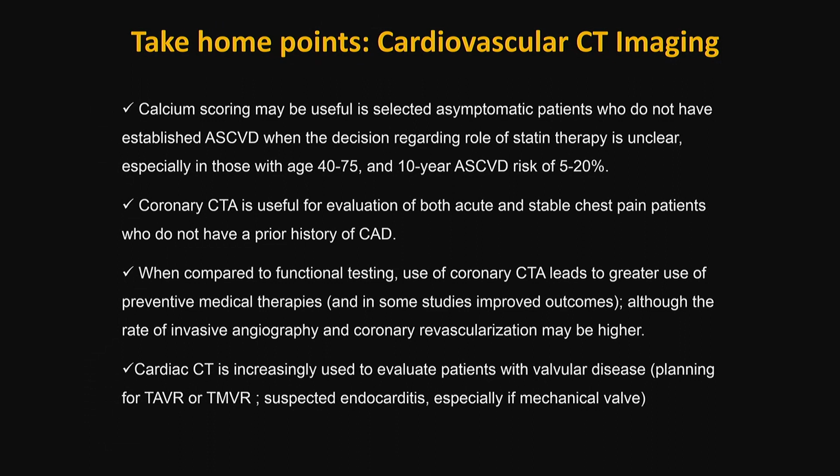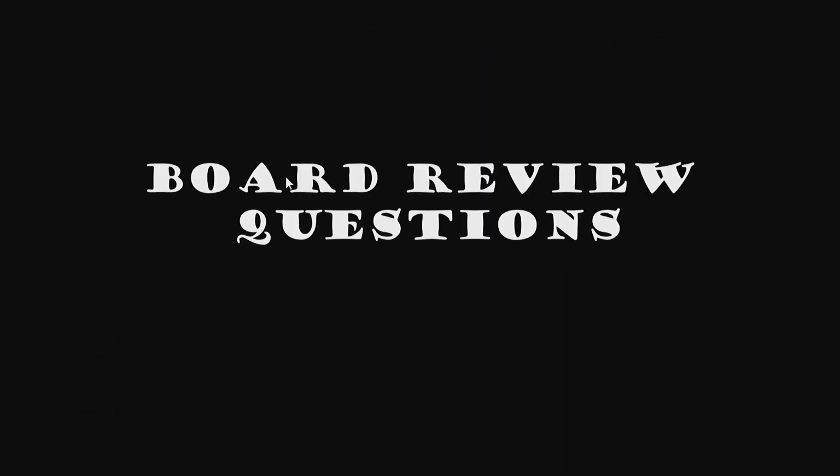The last point is cardiac CT is increasingly being used to evaluate patients with valvular disease. We can now use CT not just for planning for TAVR and TMVR procedures, but also for patients that have suspected endocarditis, especially if they have mechanical valves, because those are ones that cannot be easily imaged with echocardiography.